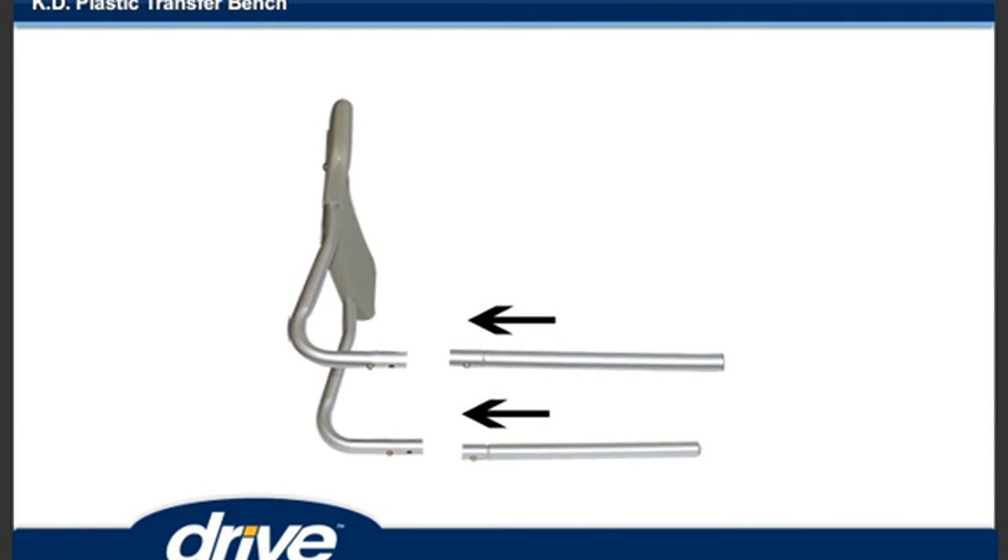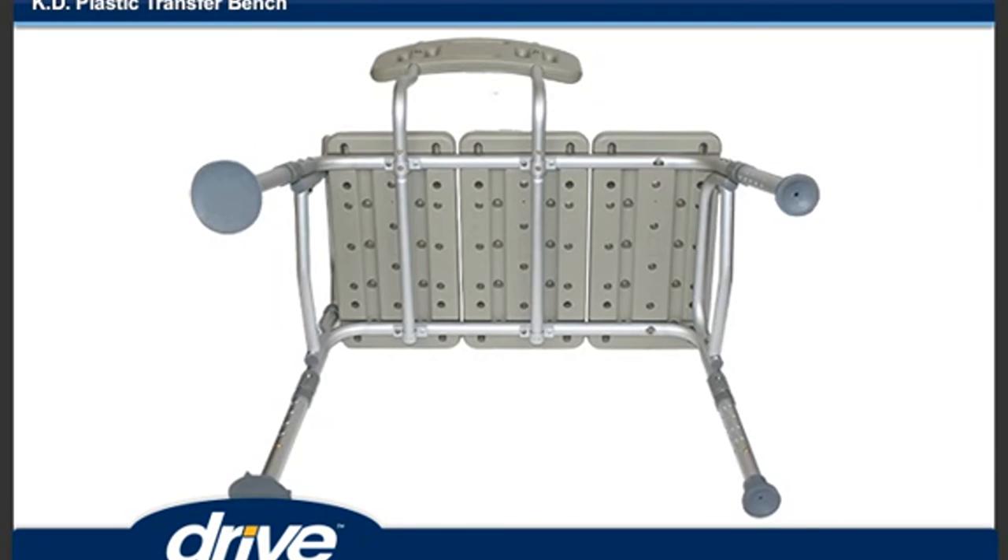Step 6: To assemble the backrest, insert the backrest tube into the backrest support by depressing the pushpin and sliding into the receptacle. Repeat for the second pole. Insert the backrest into the base by depressing the pushpins and sliding the supports through both receptacles. Note: the backrest must go through both sets of receptacles to become secure.